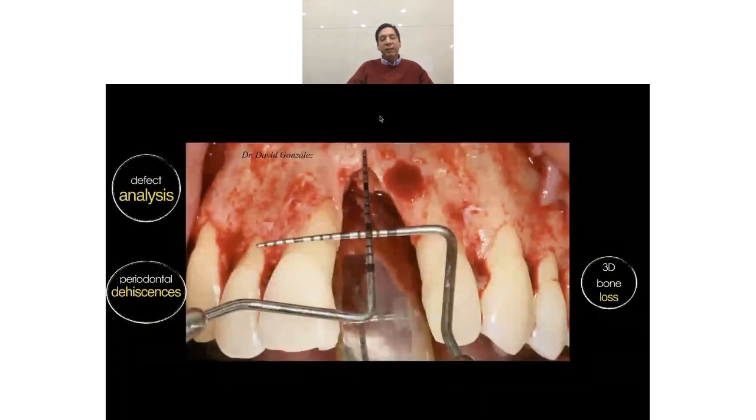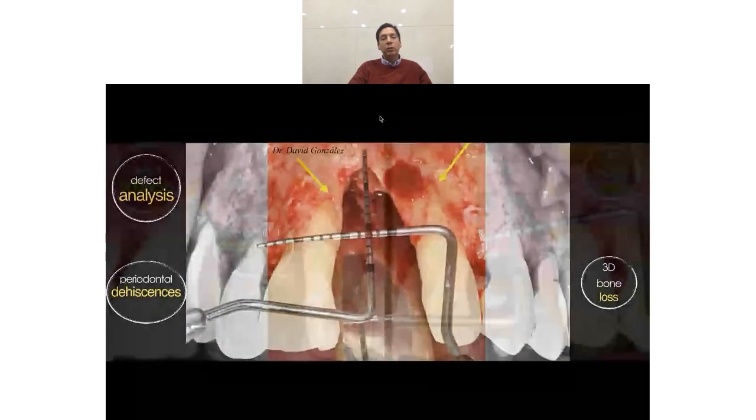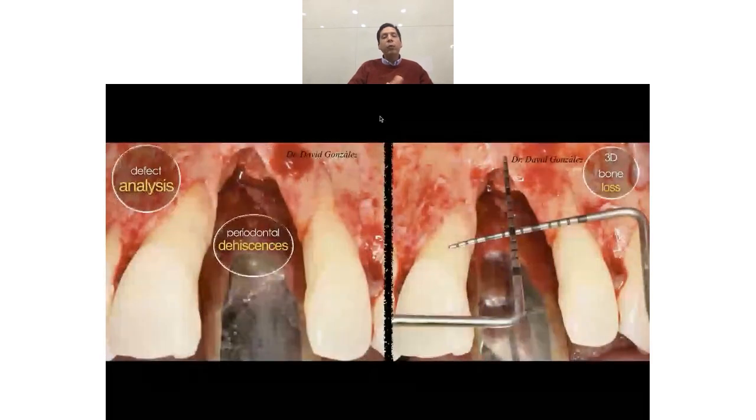And after raising the flap, this is what we have. We have this very, very huge bone defect, no palatal bone wall at all. And remember, that's communicating with the incisor canal. We can see it in the yellow arrows. And here we can see that the roots of the adjacent teeth had periodontal dehiscences.